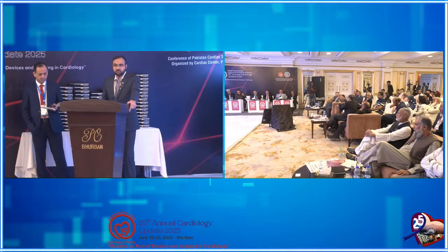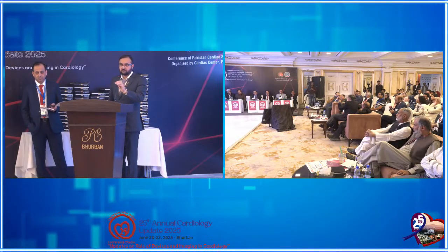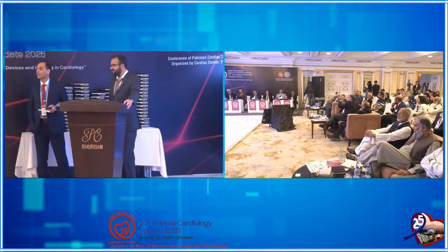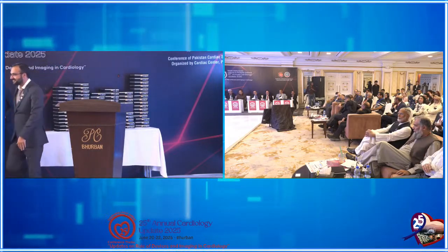I think I totally agree. ये जो कैथेटर रिलेटेड इश्यूज था, अभी जो है ना उसका मल्टीपल पॉइंट्स. ये बात लॉजिकल है सर कि जब वो स्पाइरल शक्ल में आता है और मल्टी इलेक्ट्रोड हो तो एनर्जी मल्टीपल लेवल से डिलीवर होगी, तो सरकमफ्रेंशियल एनर्जी डिलीवर होगी. ये पॉसिबल.